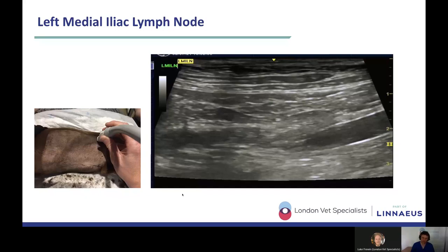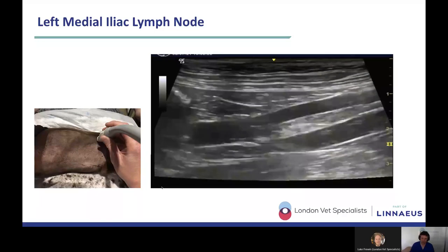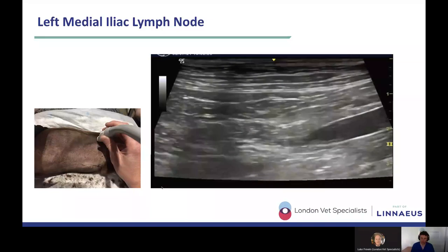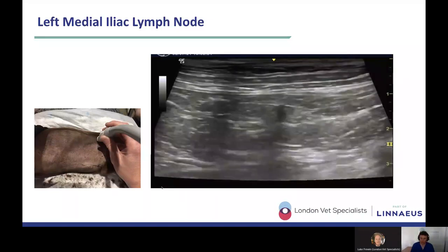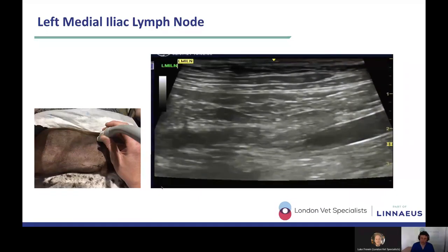So anything sinister affecting the caudal part of the patient, so anal glands, bladder, so patients that have, say, transitional cell carcinomas affecting their bladder, the urethra, or patients that have prostatic carcinomas, these lymph nodes are going to be super big. So if you can't see them, then that's fine, but get used to developing that muscle memory and looking for them, because if you do find very abnormal medial and internal iliac lymph nodes, it can be super helpful. And sometimes you can find things that the owner, that the primary vet wasn't even aware of, like anal sac.